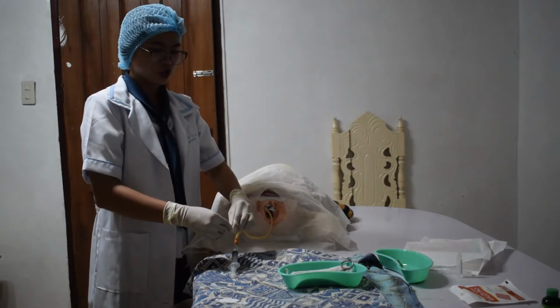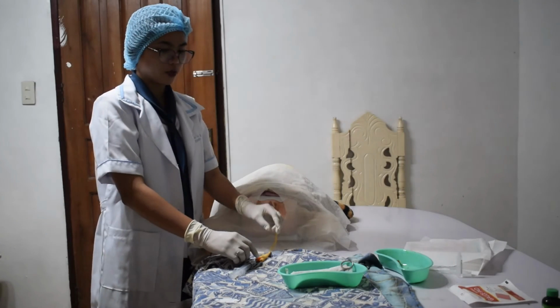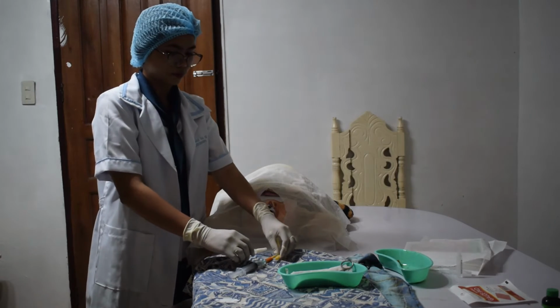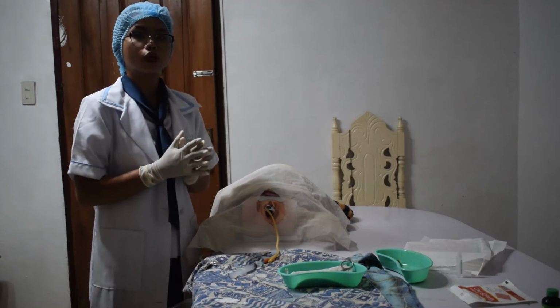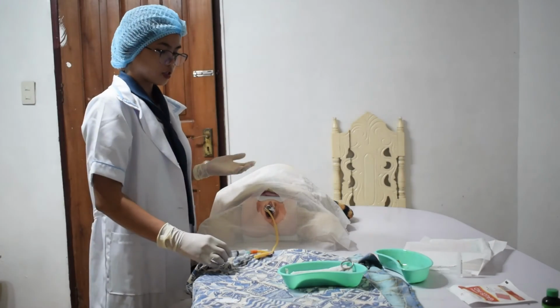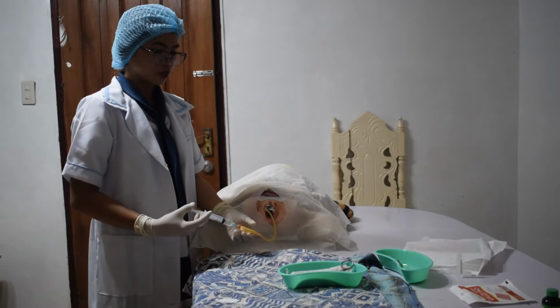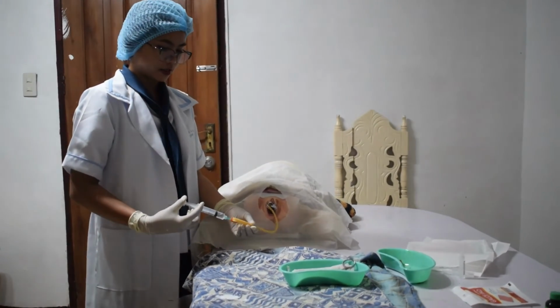Inflate the retention balloon with the volume required by the catheter manufacturer. Hold the inflation valve between 2 fingers of your non-dominant hand while you attach the syringe to the inflation valve with your dominant hand.